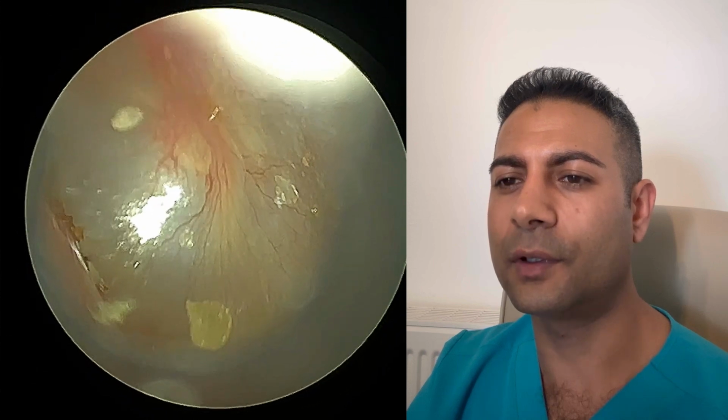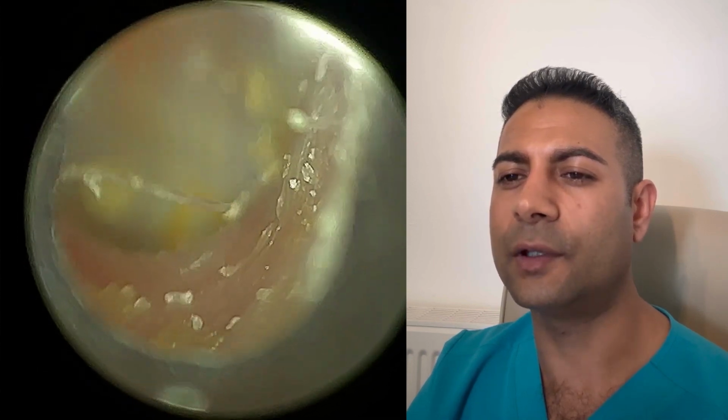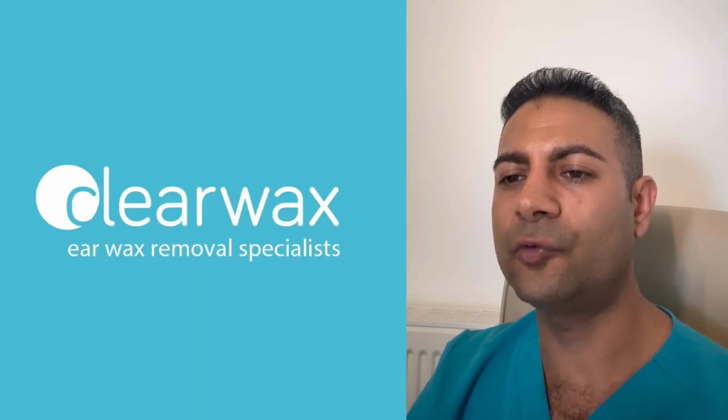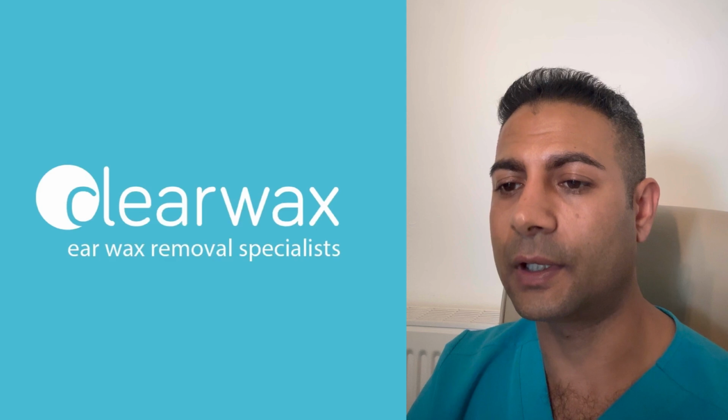So I'm just having a good nosy around. Just getting the eardrum into focus as well. So they do suffer from a bit of otitis externa, a bit of dry, flaky skin of the ear canal.